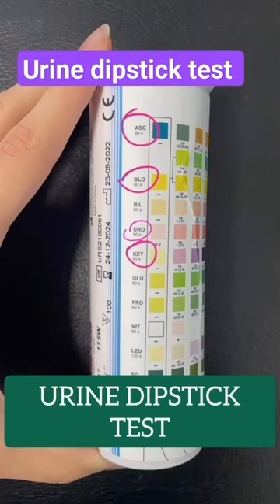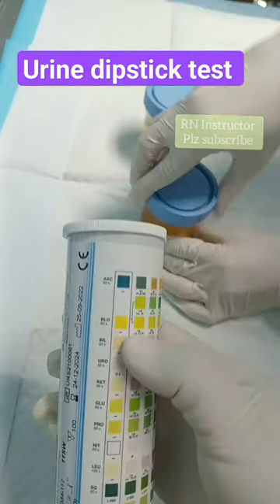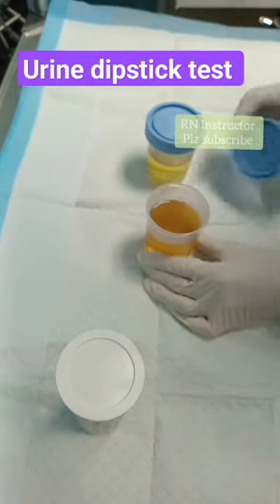This is the urine dipstick container and these are the urine sample bottles needed for this test. As you can see, there are different color pads on the container, and with the different tests we are able to analyze the urine dipstick test.